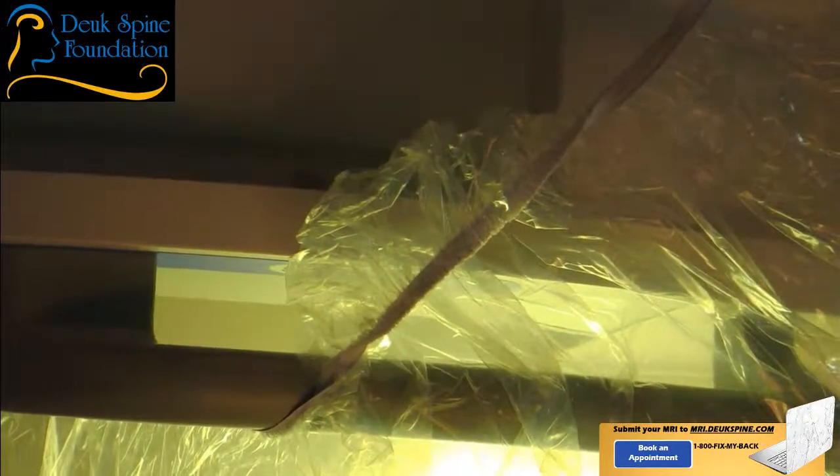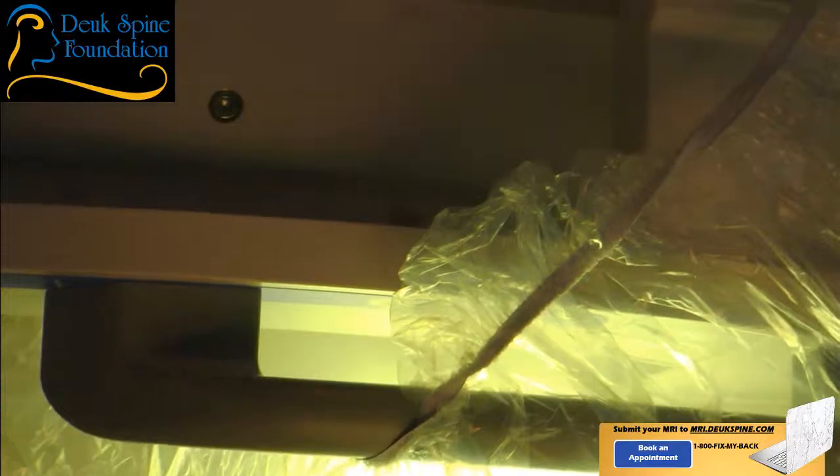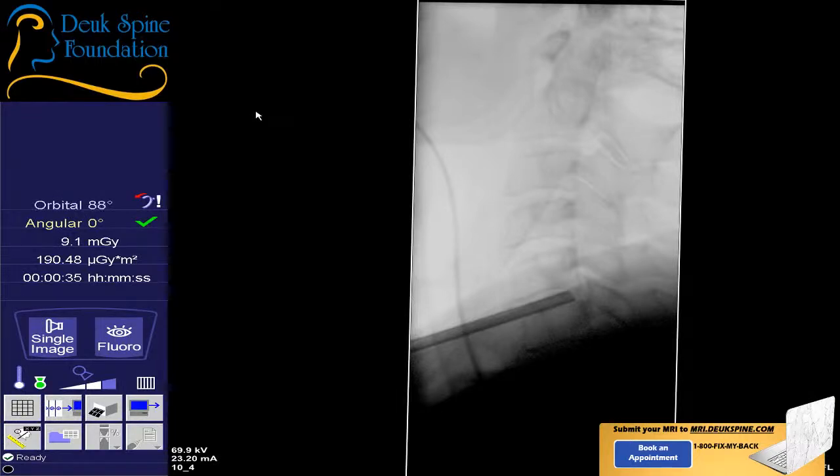Take your time. All right, so you do a shoulder pull, a shoulder squeeze pull down. I'll do what I do, and we'll get the head in a little bit of neutral distraction. I'll tell you, not yet. So you can see all the little pieces of disc herniation that have floated out and are sitting right here. Luis, you want those?